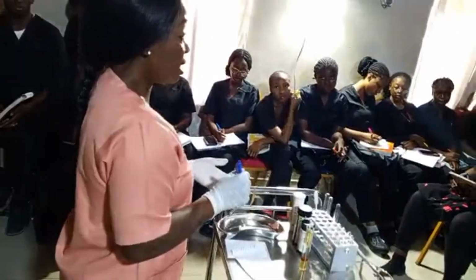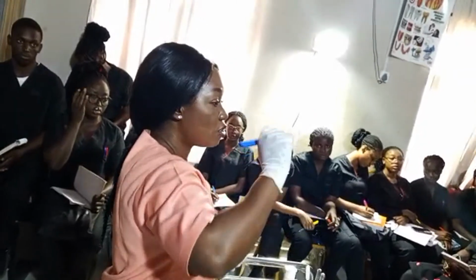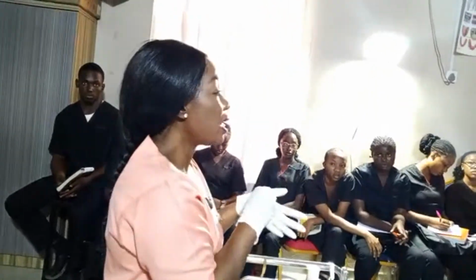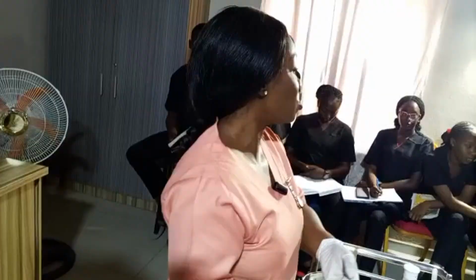Remember, this is a practical class, right? So when you are in your theory class, they explain it. If there are ketones in the urine, it indicates that there is more of a problem with these patients that we are seeing, right? So the patient needs to be treated on that.